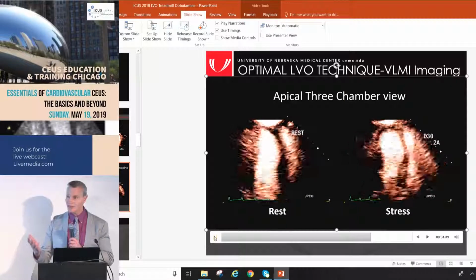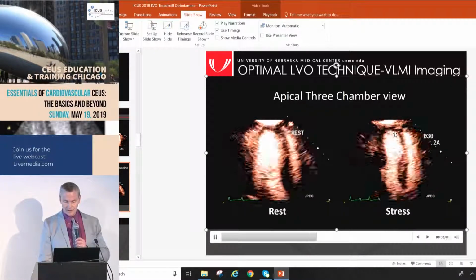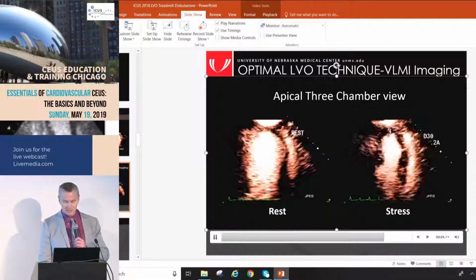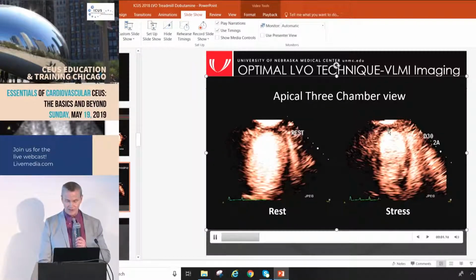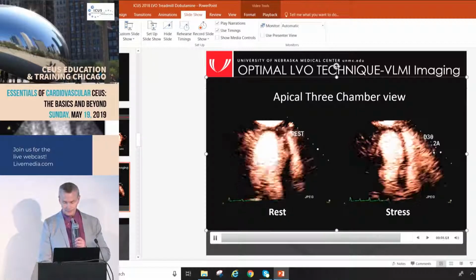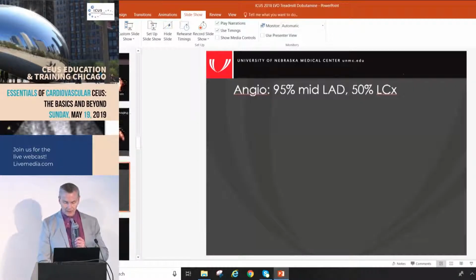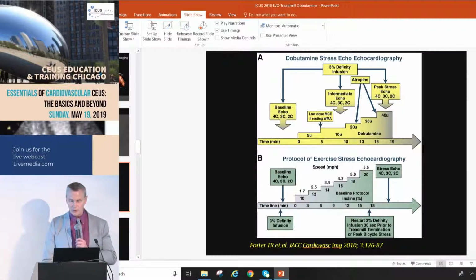If it's scar, it's not ever going to replenish, okay? Like this apical portion you see here, this never really ever replenishes. It's dark there. We'll come to that issue in just a second, and it stays hypoperfused. So that's, again, like I said, where we see this being extremely helpful, and this is basically our protocol.